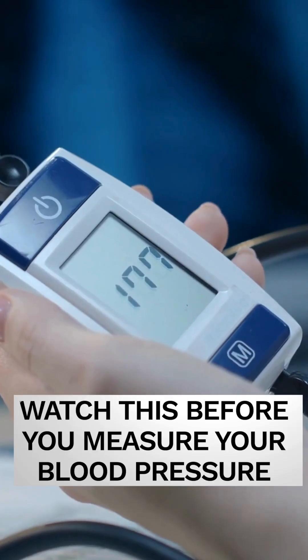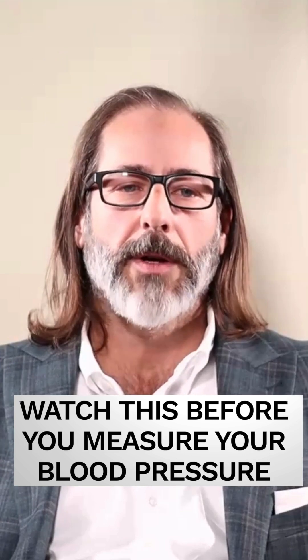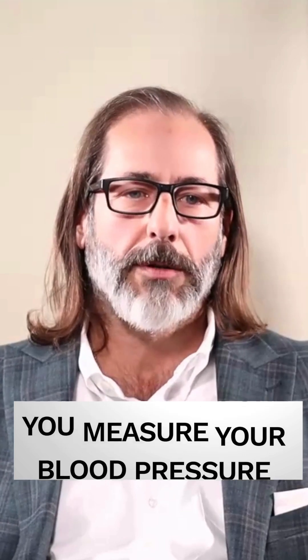Why are you measuring your blood pressure to begin with? Any of these automated blood pressure devices have a large error range. They're not very accurate at all — they could be off by 20 millimeters.